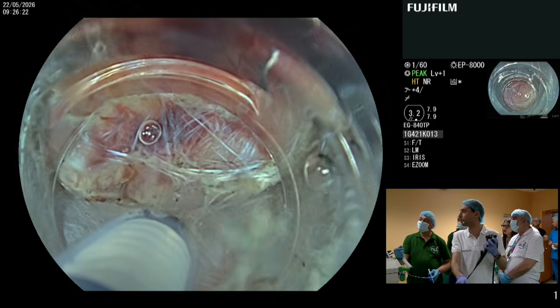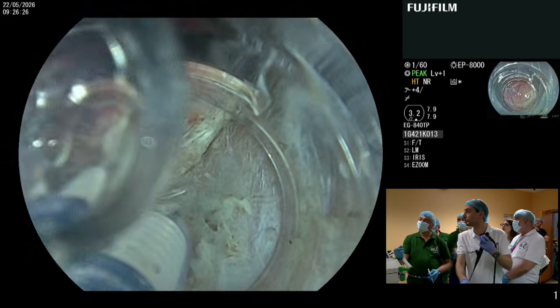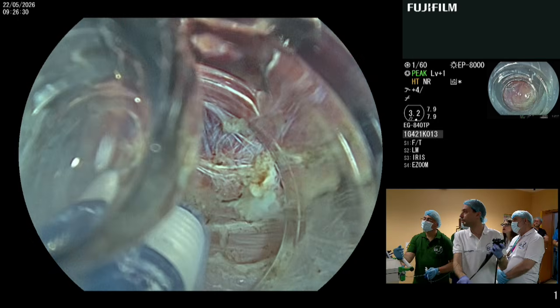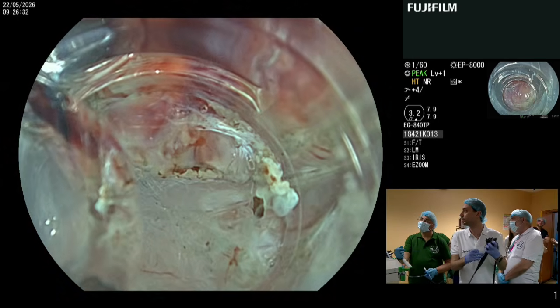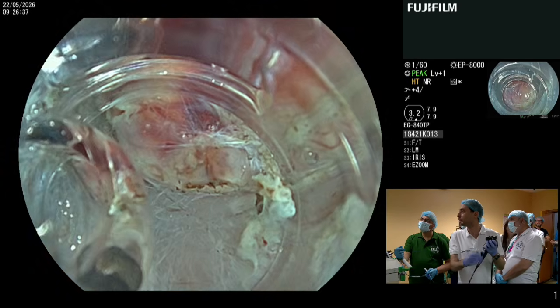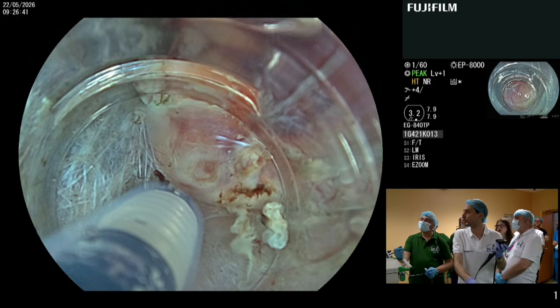We may do some intermuscular dissection right now. Okay, so we have started the intermuscular dissection. We see the muscle. I will try to inject and dissect as much as I can before I induce perforation.